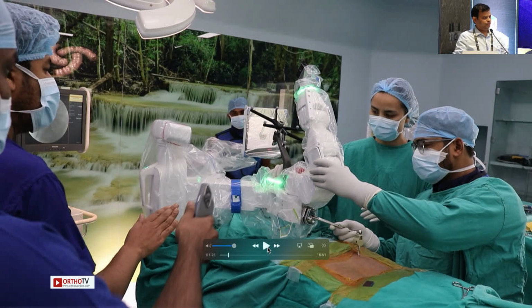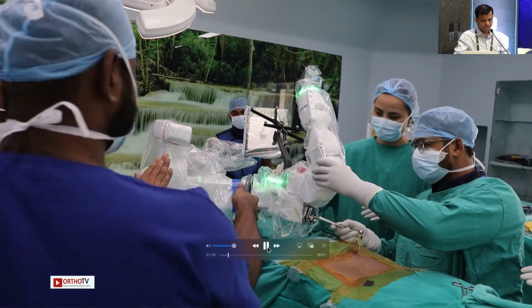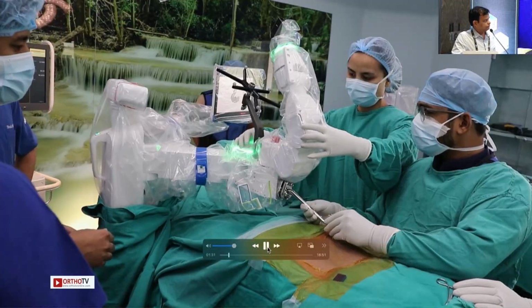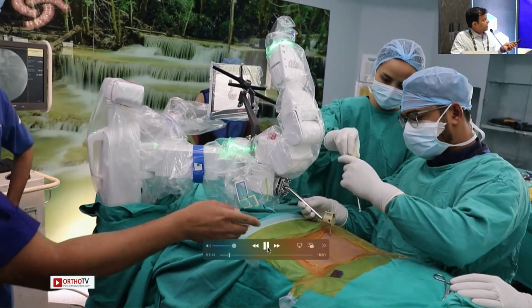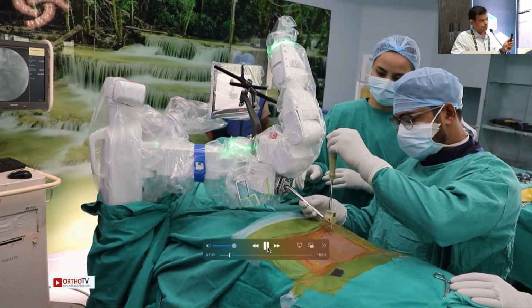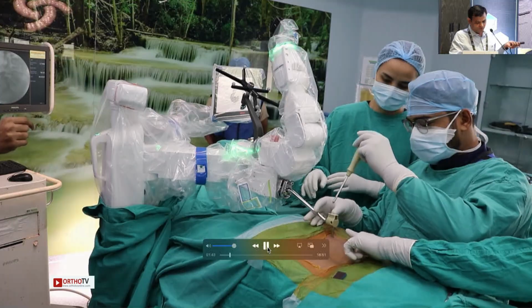If you are having a scan and plan workflow, where you are doing a preoperative CT scan and you are registering the patient intraoperatively, does Excelsius register automatically, or do you have to do it manually? So for Excelsius, it can register the O-arm scan, but there's an array that you need to place onto the patient so that the O-arm scan can talk to the Excelsius robotic system. You can do it also for this one. So that's the navigation reference frame, and then you have to again marry your navigation to the robot. That we will do in the next step.